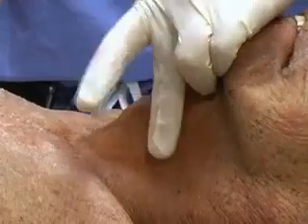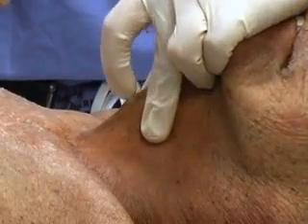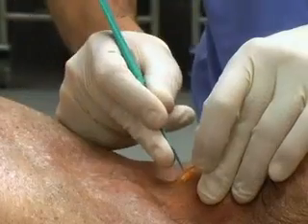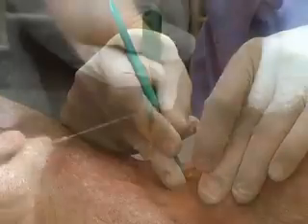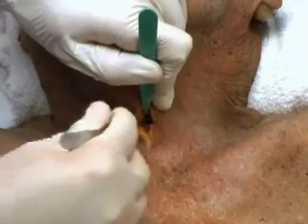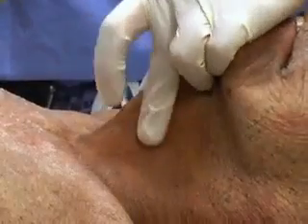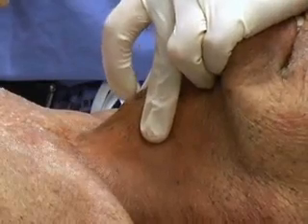In this video, cricothyroidotomy will be demonstrated on a cadaver to illustrate pertinent landmarks clearly. Directions are given for a right-handed operator. Site-specific designations should be reversed for left-handed operators. To perform cricothyroidotomy, stand on the patient's right side.